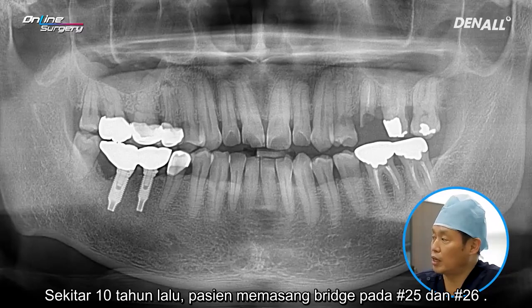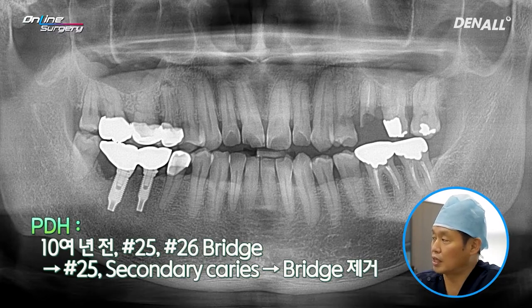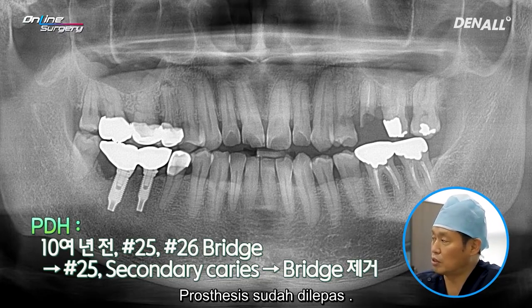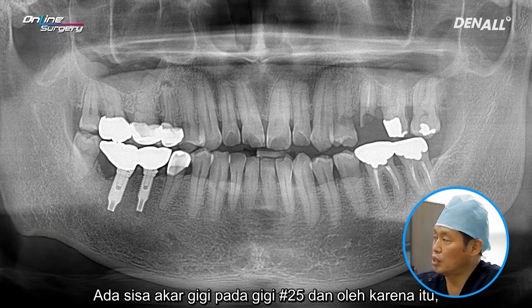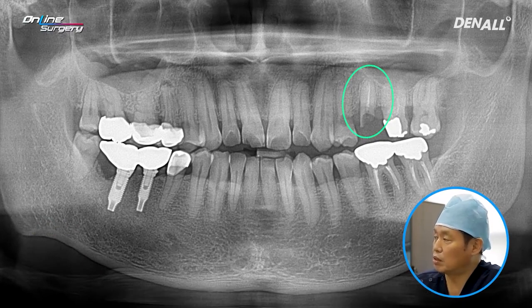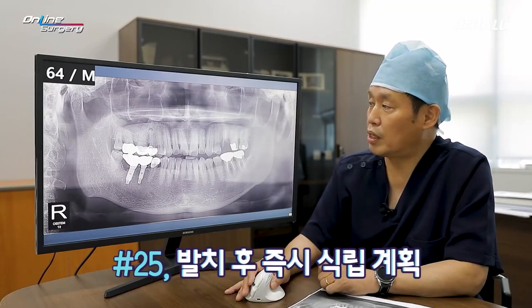Approximately 10 years ago, a bridge was done in number 25 and 26. In number 25, there was secondary caries and there was an issue. The prosthesis has been removed. In number 26, the prosthesis was to be refabricated. There's a root rest in number 25 and therefore immediate implant placement after extraction was planned.